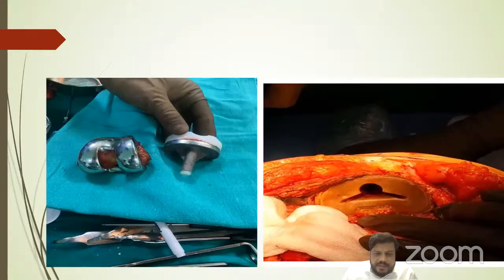And the tibia came out. There was no cement sticking on the tibial base plate. So it was also maybe not very well fixed.